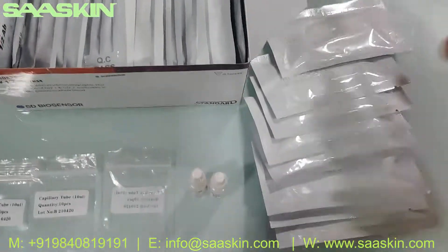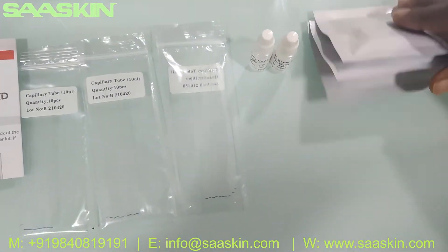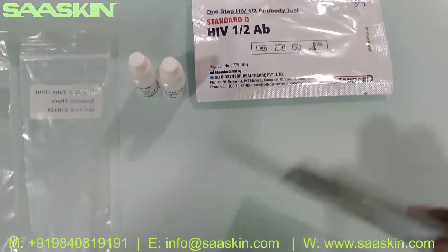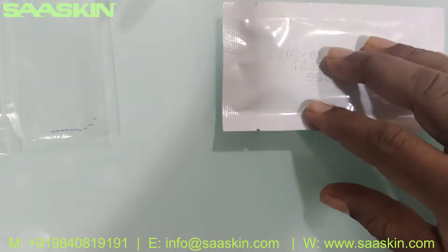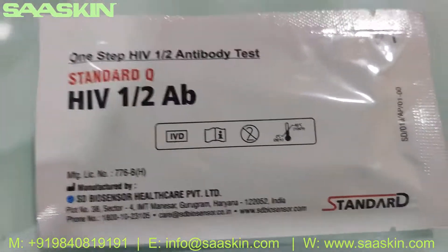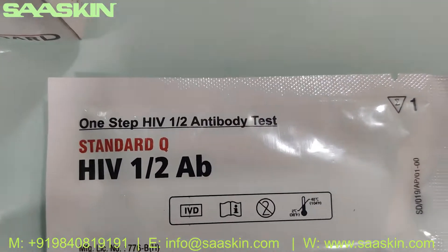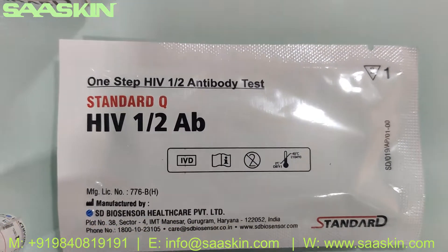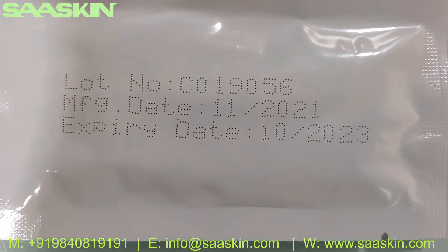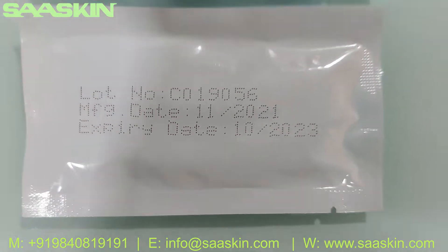So you have 30 test cassettes. Let me take out a couple of cassettes here. You can see the test cassettes — it's an antibody test for HIV 1 and HIV 2. You can see the expiry period; on a standard it is 2 years of expiry.